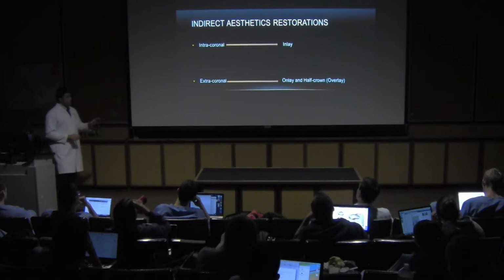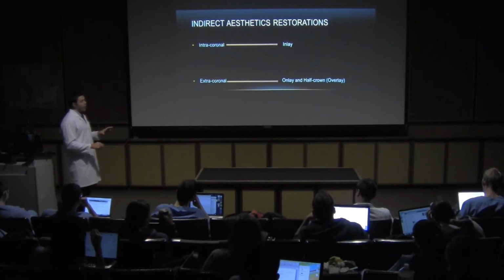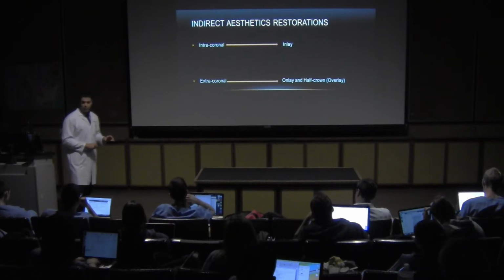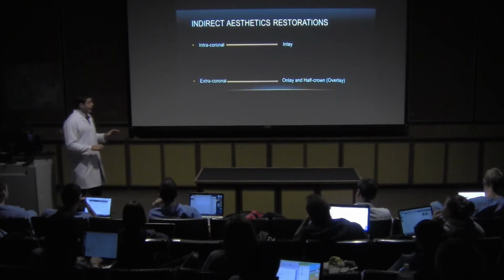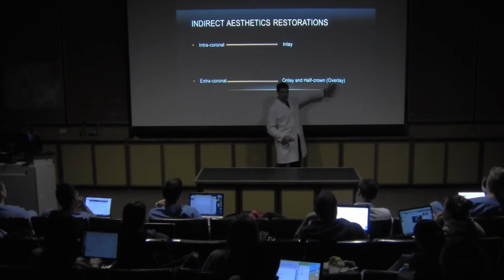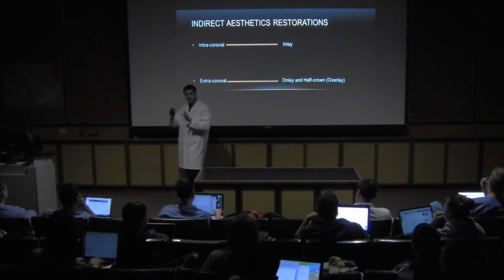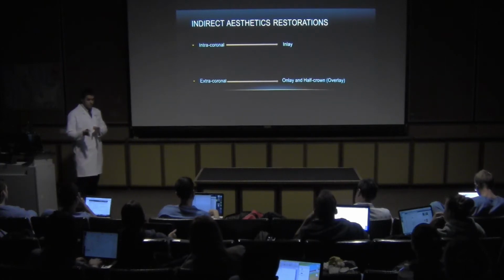So the concept here is when we have an inlay prep, we consider an intracoronal restoration. Okay? And if we have only, here we can call half crown or overlay, is the same thing. Okay? Half crown and overlay is the same thing, but both are different from onlay. We're going to see this difference, right?